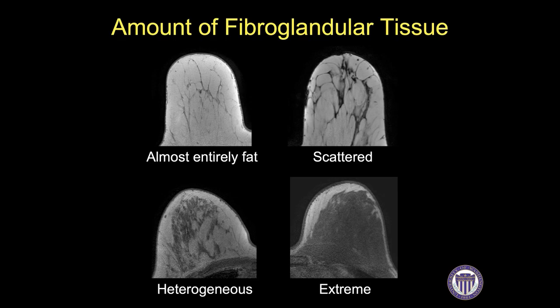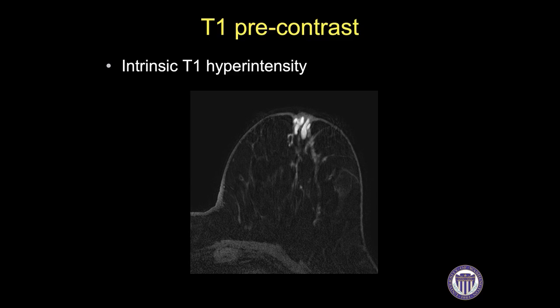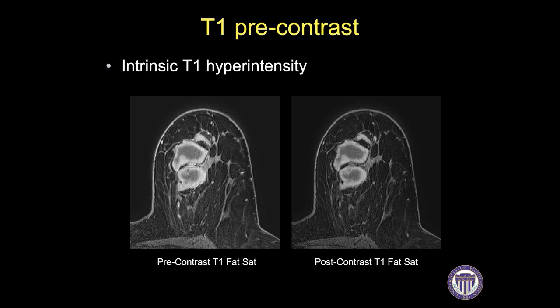On the T1 non-fat saturated images, I also assess the amount of fibroglandular tissue, similar to breast density on mammography. There are four categories: almost entirely fat, scattered fibroglandular tissue, heterogeneous fibroglandular tissue, and extreme fibroglandular tissue. I then quickly look at the T1 pre-contrast fat-saturated images for things that are intrinsically T1 hyperintense, such as proteinaceous fluid or blood in dilated ducts, or a post-biopsy hematoma — so I don't misinterpret these as enhancing lesions.